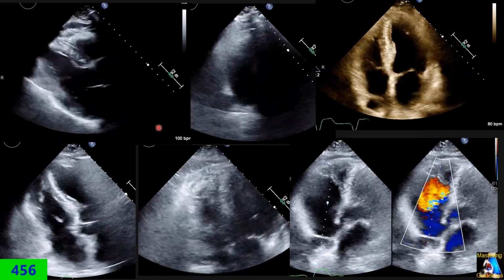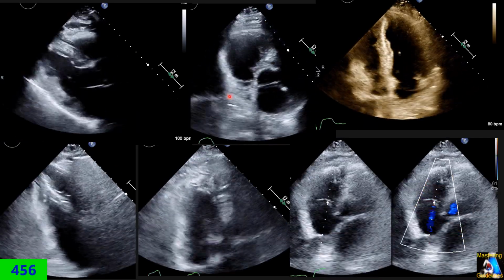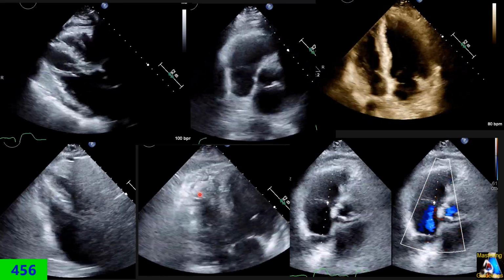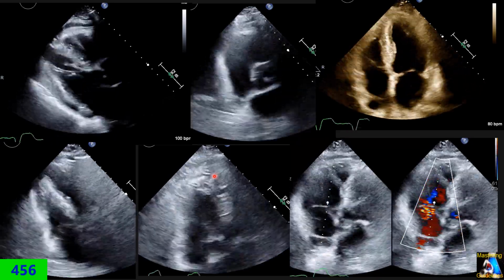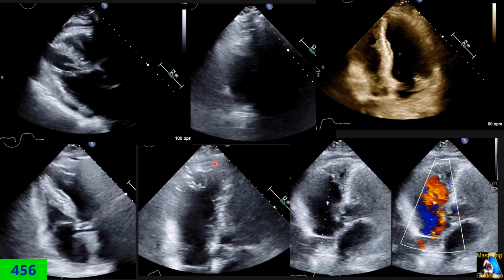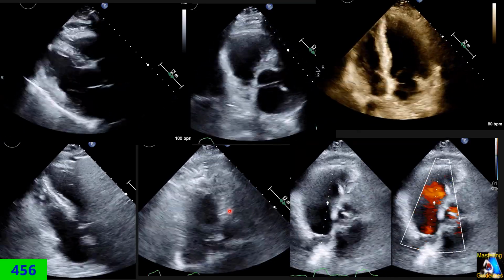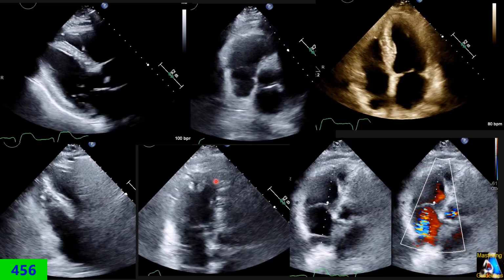We have to remember that the right ventricle free wall is very thin. Some spots are 2, 3 millimeters, or sometimes 2 millimeters thin, especially close to the apex. And the temporary pacemaker will be anchored and placed at the tip of the right ventricle, exactly at this spot. When we scan those patients, we have to go off axis, especially medial off axis. This view is much better for checking the apex of the right ventricle.